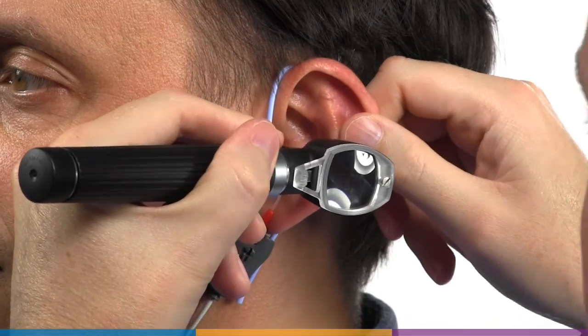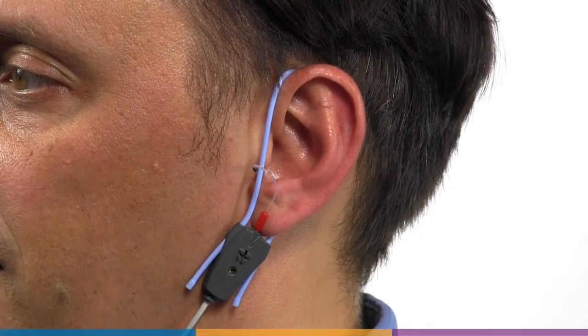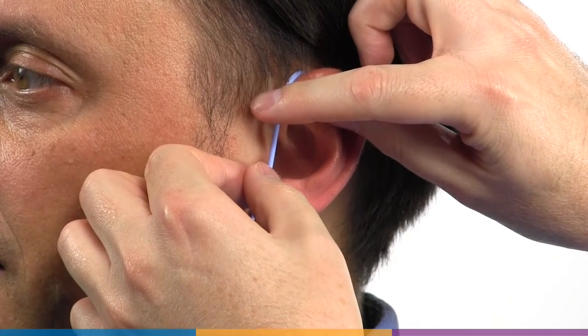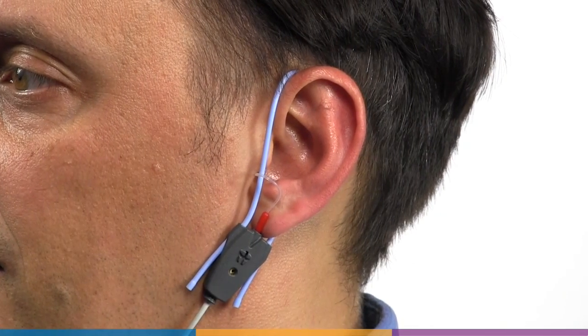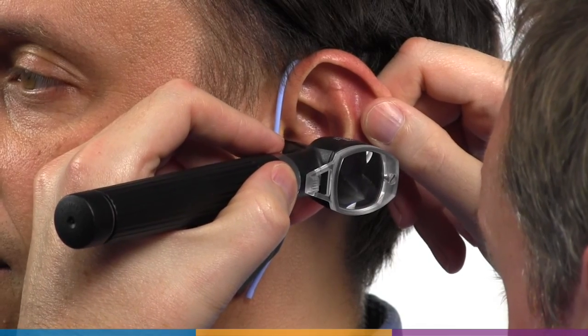You may also place a dab of lubricant on the middle of the tube to assist with earpiece insertion. This will help the tube stay in place and also help prevent slit leaks. Check with the otoscope to ensure that the probe tube tip is correctly placed within 5 mm of the eardrum and adjust if necessary.